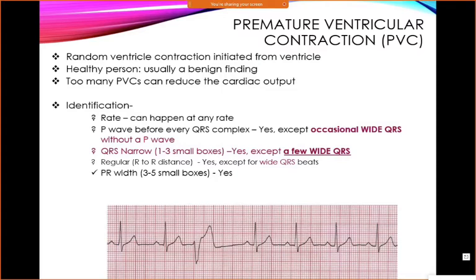You can tell that it's ventricular because look how wide it is. One, it looks weird and abnormal, but here, this QRS, look how wide that is. That is like 4 boxes wide. And then it's got like this random thing because it's resetting funny. So QRSs, I mean, they're very noticeable. Premature ventricular contractions, they're very normal. And they're not very normal, they're irritable. Usually irritable hearts have premature ventricular contractions. Usually ventricle pacemaker cells don't do their own thing. And the reason it looks upside down and wide is because it's coming from a ventricle source.